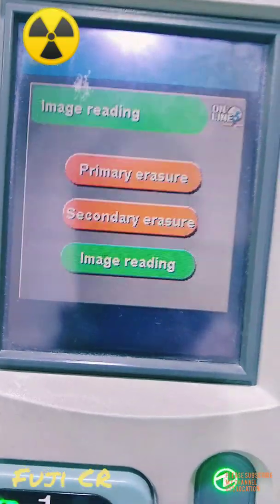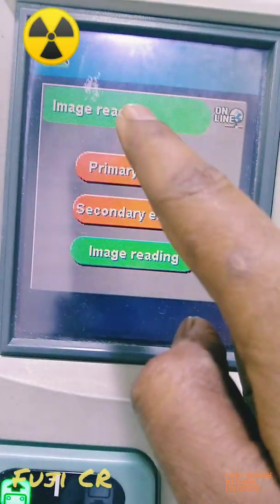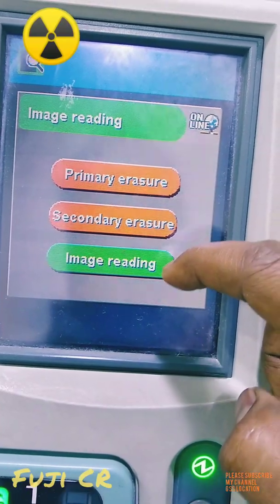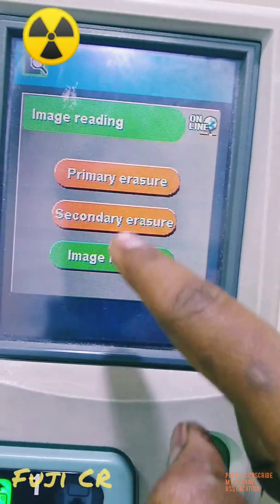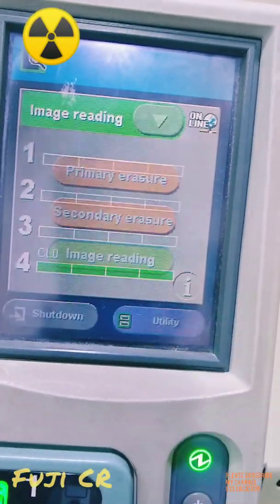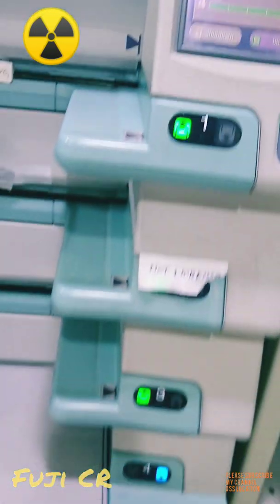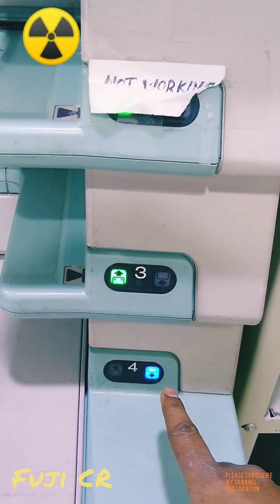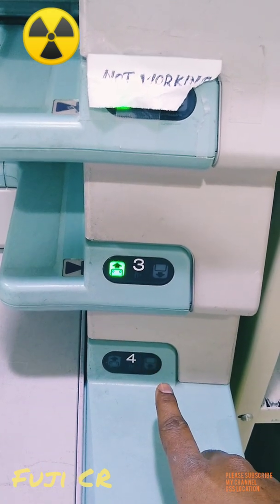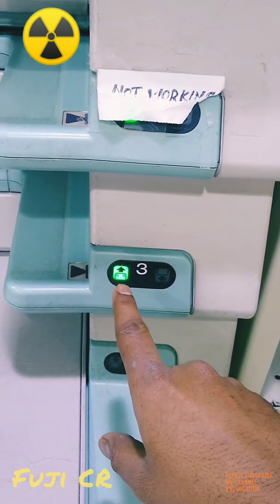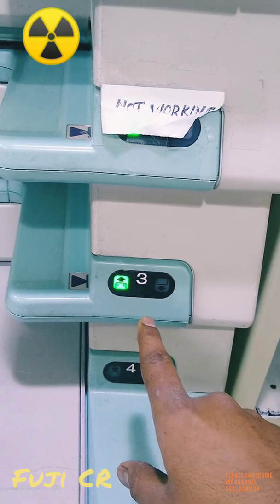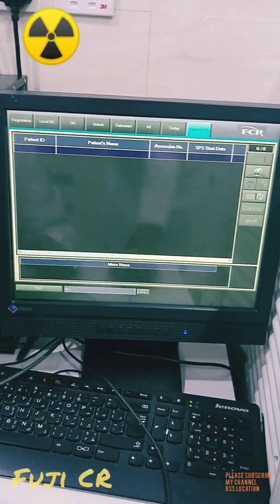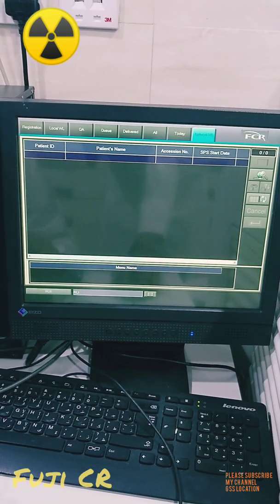This is the cassette reader. We have the DX 5000 — it has four slots, so we can read four cassettes at a time. There are three indicator options: blue light means the read is already finished, indicating to take out the cassette, and the screen is ready for the next read.